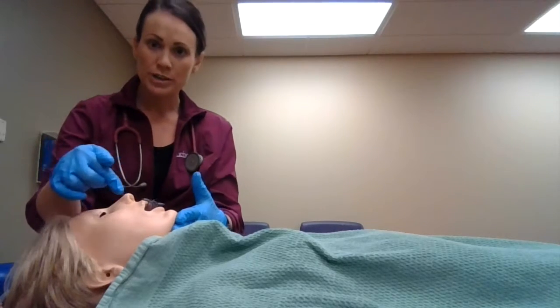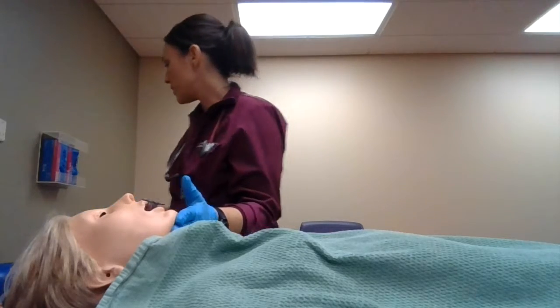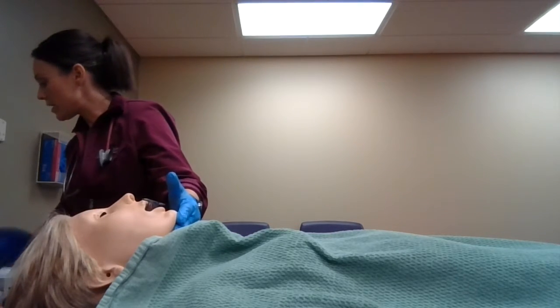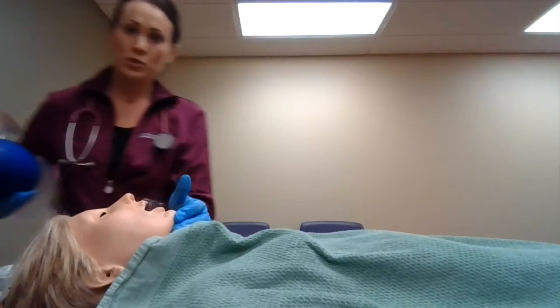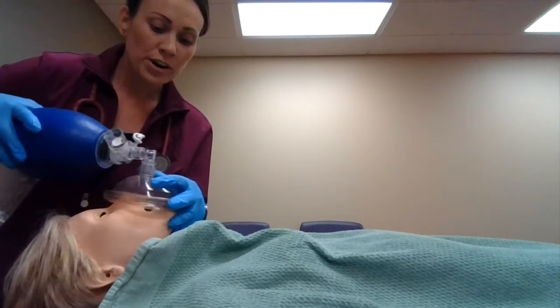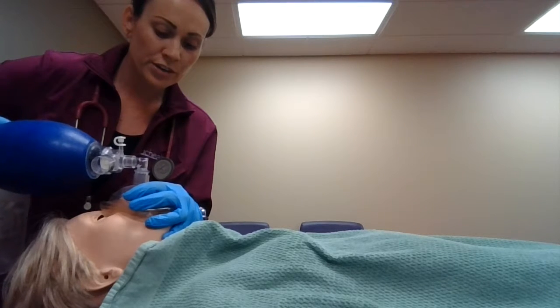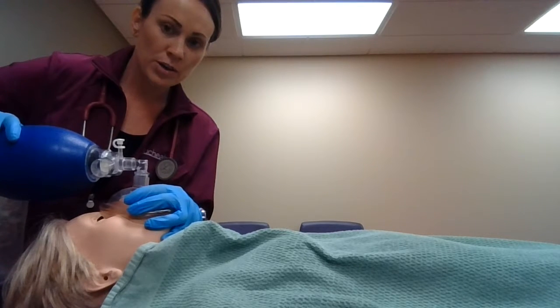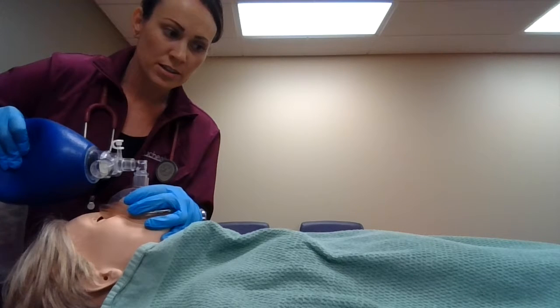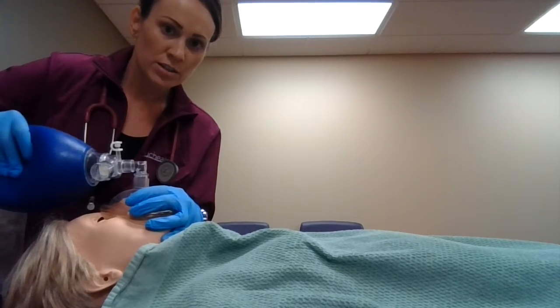Now I have a secured airway to administer oxygen, or administer breaths, to Mrs. Smith. So I have my bag hooked up to the oxygen tank here, and I'm going to be very careful as to not jerk the patient, keeping that 2-finger head tilt. I'm going to go ahead and start administering breaths. What I'm looking for is if Mrs. Smith is having any chest rises.